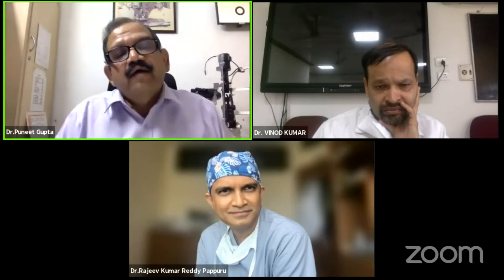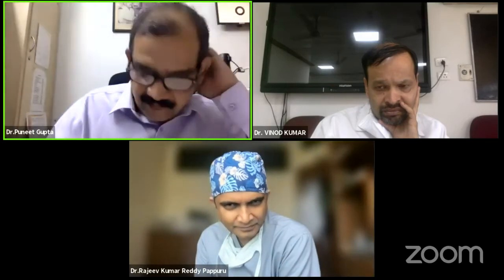How much would be the cost of this camera? The cost of the camera is I think 30,000 rupees. What specifications do you have? The recommended camera in the article that I read was GoPro 5, but GoPro 5 is an old model. Now I think GoPro 9 is available, but when I saw the configuration, I found GoPro 7 best suited for this. So I utilized GoPro 7, which cost me around 30,000 rupees, and it is available on Amazon and everywhere.